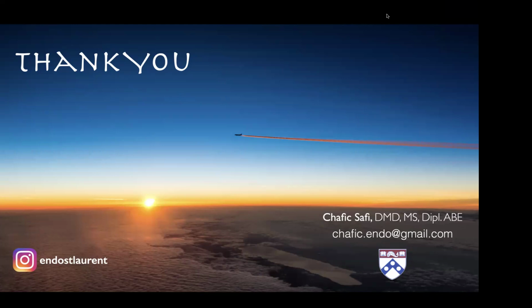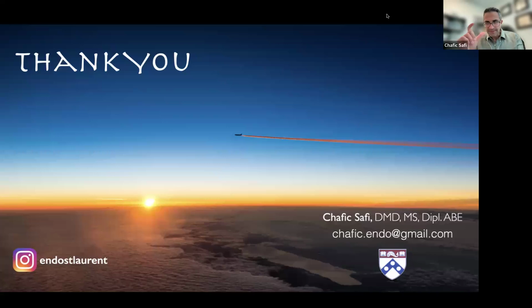Okay, what training or learning curve should I expect when incorporating anatomically centered endodontics? So this is what I mentioned right before in the previous question. I suggest that you start with the simple cases, let's say central incisors or basic cases, so that you have a feel of how the file is employed, what is the feeling with the handpiece, how you would use the bioceramic sealer. So there is a bit of a learning curve.